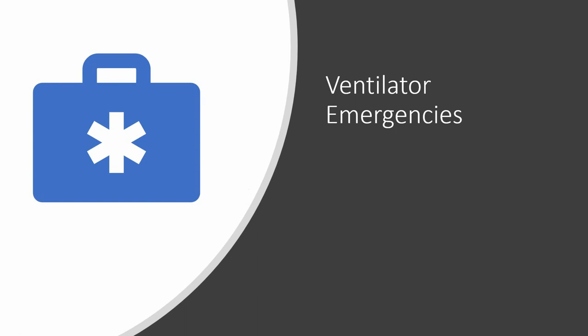Ventilator emergencies, or how to handle ventilator emergencies, cannot be understated. Patients die on ventilators as a result of not appreciating that the ventilator could be causing the patient to become unstable, or because they did not properly respond or address ventilator alarms. So anytime the ventilator alarms, it should be considered an emergency.